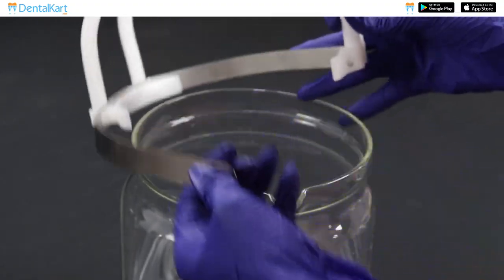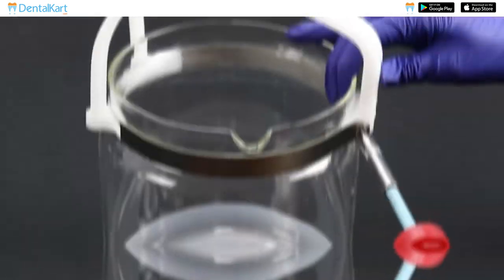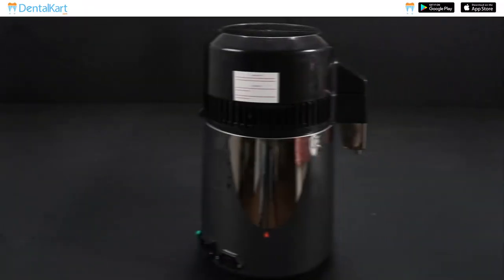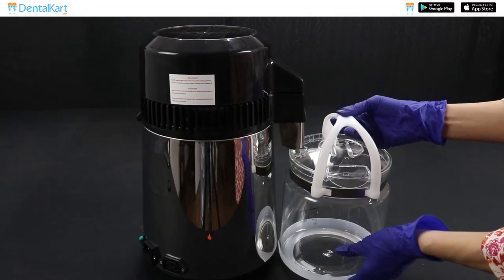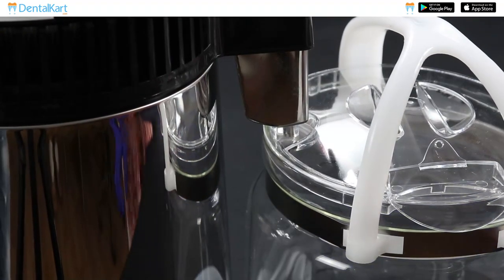Remove one screw from the handle of the glass kettle. Place the handle band around the neck of the kettle and then tighten the screw back in place. Put the bottle cap and place the glass kettle near the distiller in such a manner that the distiller's water outlet is connected to the glass kettle nozzle.